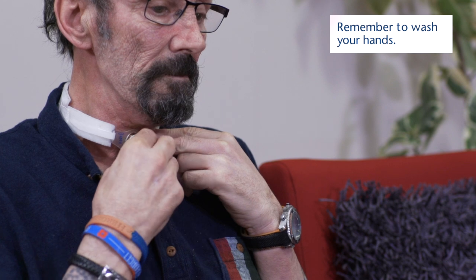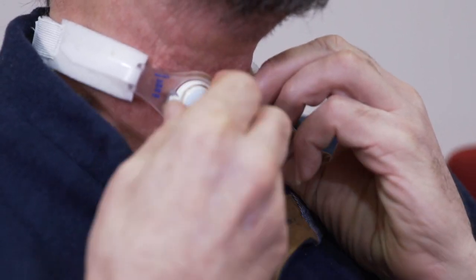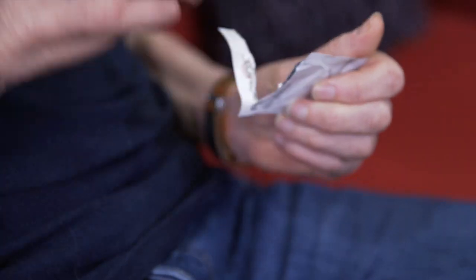You will remove the inner tracheostomy tube and replace it with the new inner tracheostomy tube, and this will click into place. You will then clean the surrounding skin.